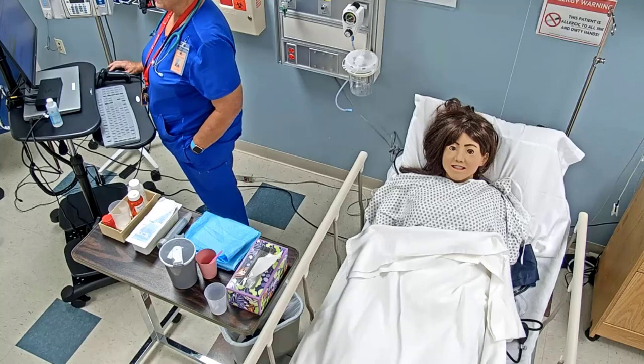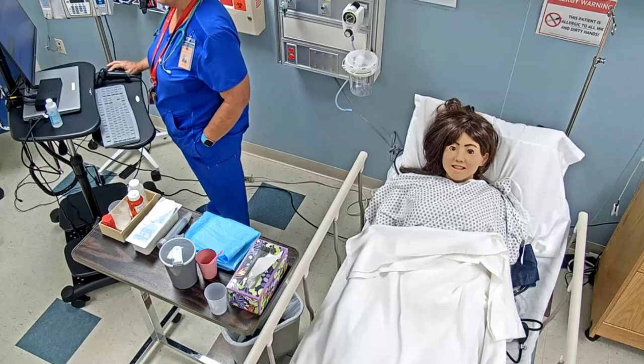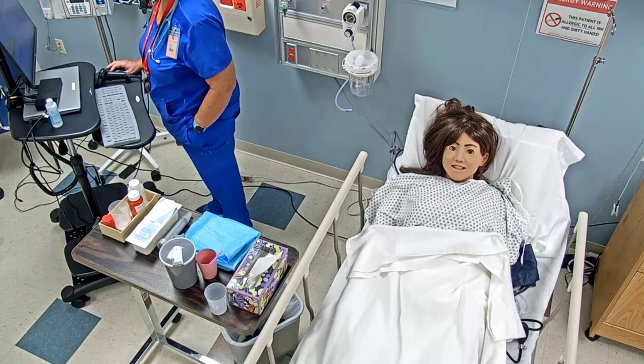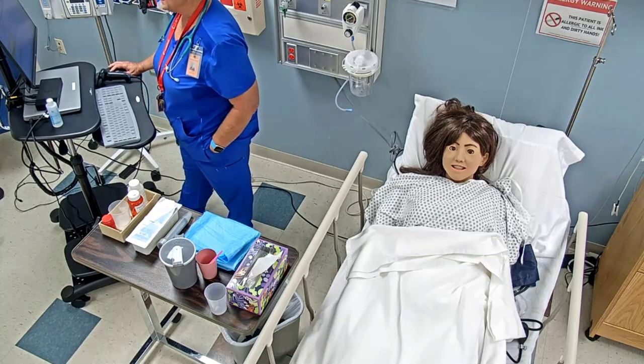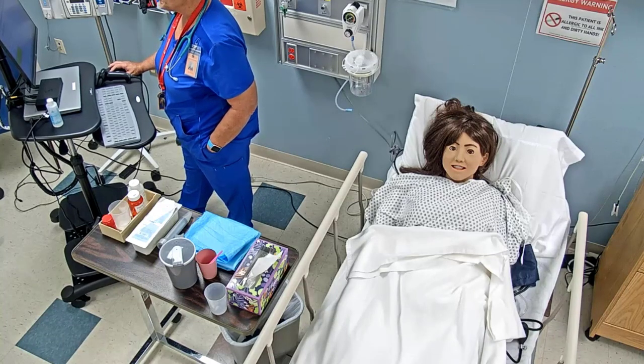So now that I know, I'm going to start comparing one medication to the MAR at a time. So Anna Taylor, date of birth 4/24/1991, no known drug allergies. I've got metoprolol 100 milligrams PO daily per peg tube. So I'm going to flip over to my MAR.